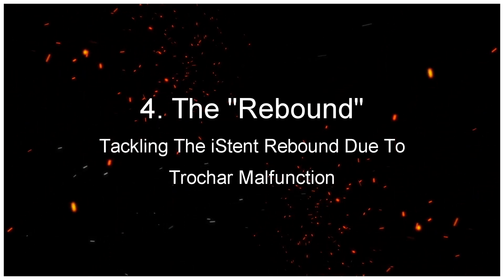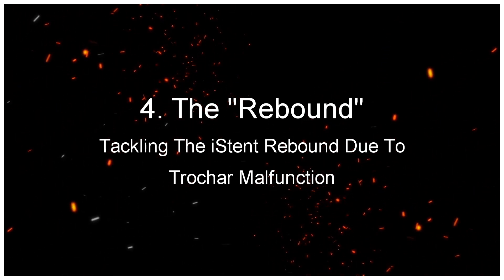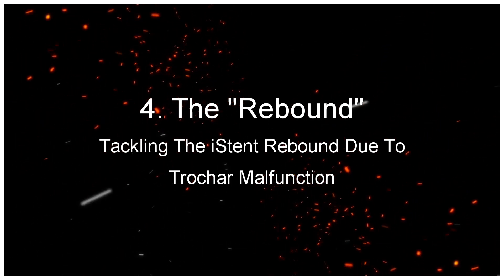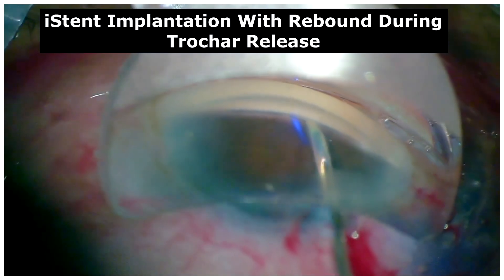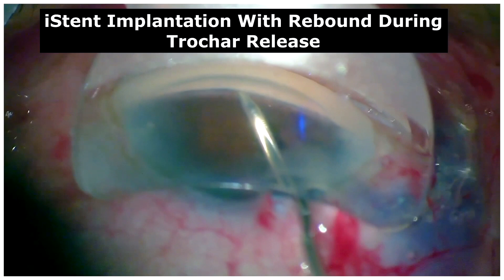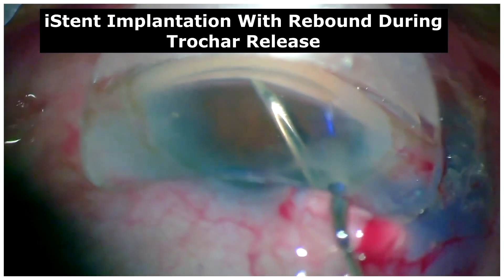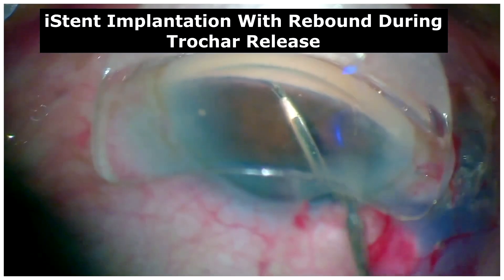The Rebound: Tackling the iStent rebound due to trocar malfunction. In this case, following the successful gliding implantation of the iStent into the trabecular meshwork, due to trocar malfunction, the iStent rebounds during the opening of the claws of the trocar.